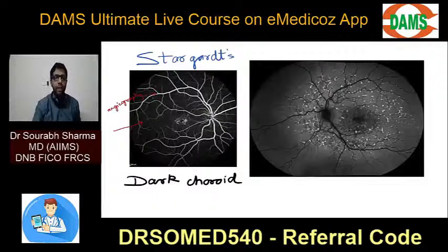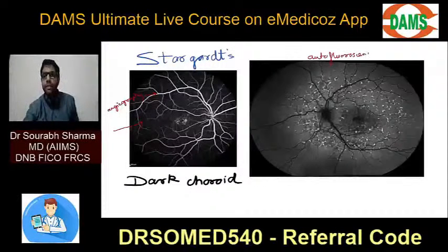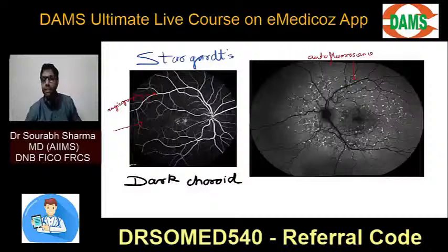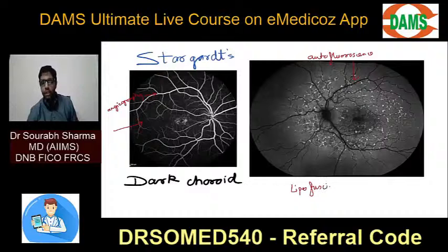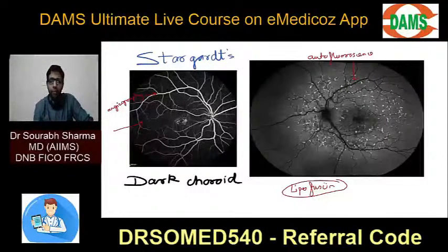Why? The vessels have dye. This is autofluorescence. Why? See the vessels. Vessels are dark. And see this. These are lipofuscin deposits. White are retinal flecks. These are lipofuscin deposits, which I have told you already. They are deposited in Stargardt's dystrophy, and this lipofuscin is deposited all over the retina.